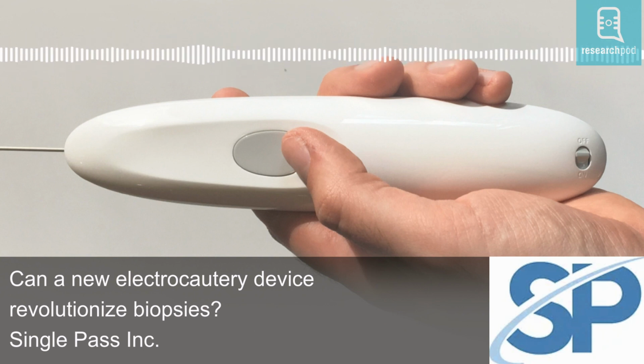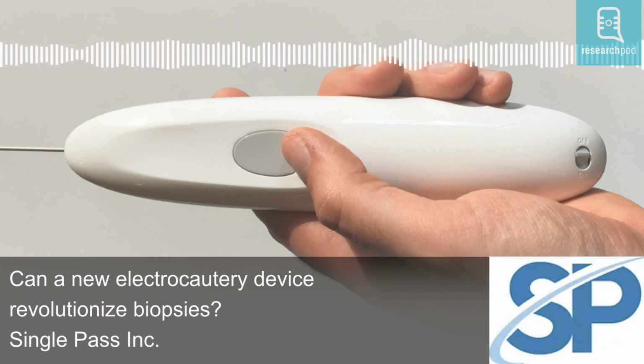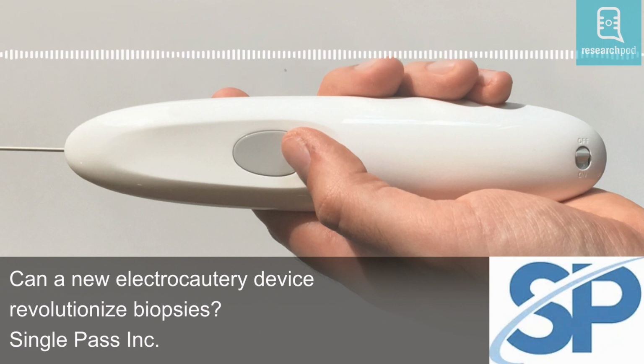Healing through electricity and heat might sound slightly odd at first, but cauterization is a fast and effective way to stop bleeding. It is the same way surgeons stop bleeding in open surgeries. It can also help reduce post-operative pain and scarring in patients.